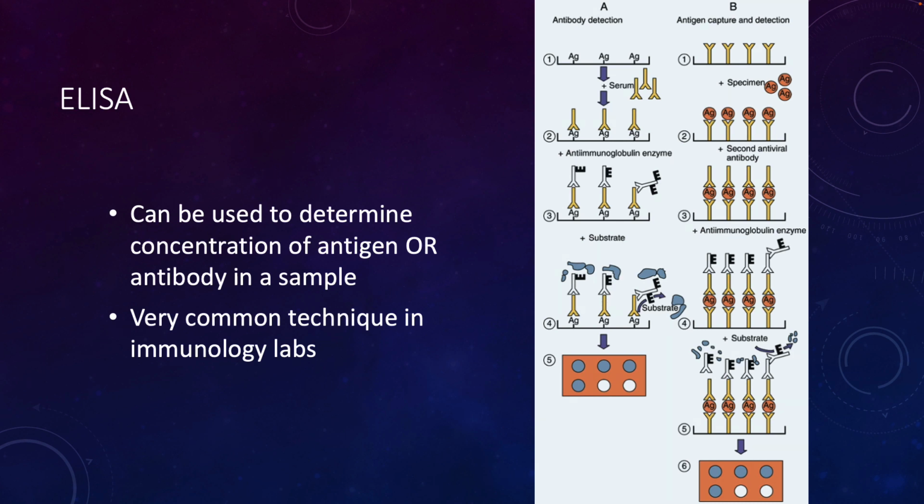And what happens is there's a control line. So it looks for, well, are there human proteins in here? Yes, perfect. That's your control line. But then it's looking for COVID proteins. So are there COVID-19 proteins in your sample as well? And that's when the test line will become positive, because you'll have a color change when you have this type of antibody antigen interaction. So it's looking for your nasal passages specifically to have COVID-19 antigens.